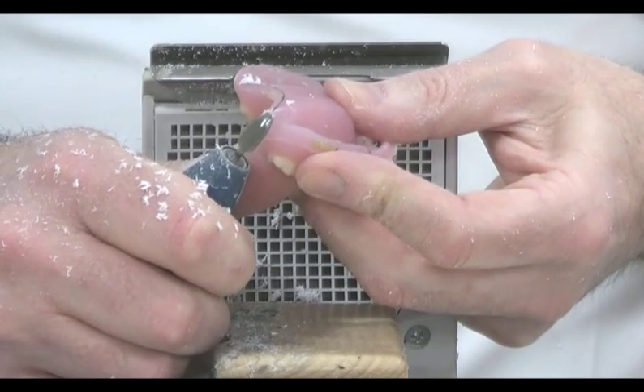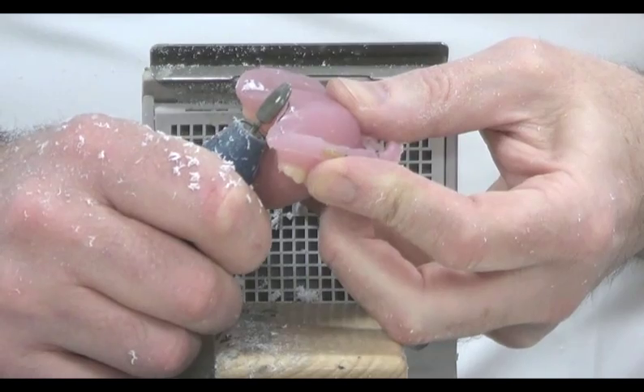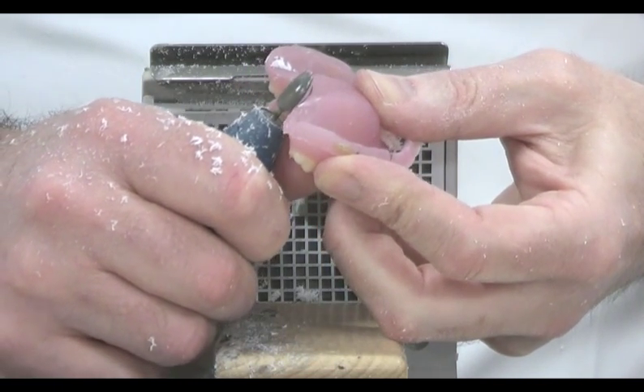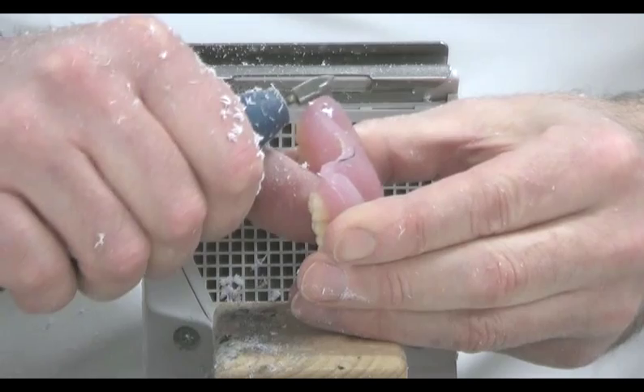Having trimmed the lower denture, we now turn our attention to the upper. In this case we need to trim the post dam area to the correct dimensions. A metal burr is used to come in towards the raised edge that has been created, and once again a variety of burrs can be used to achieve the correct finish.